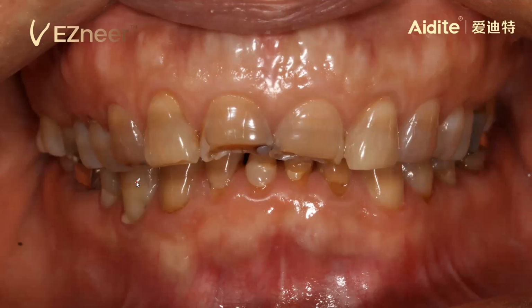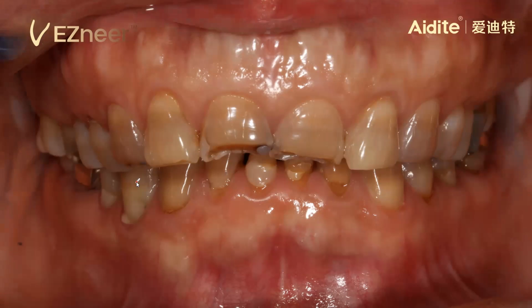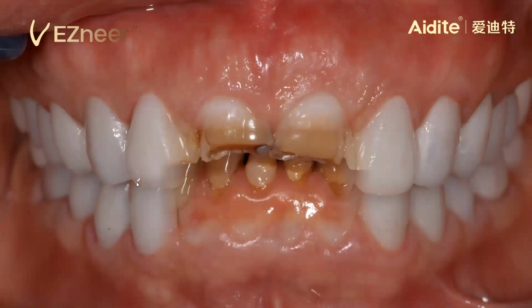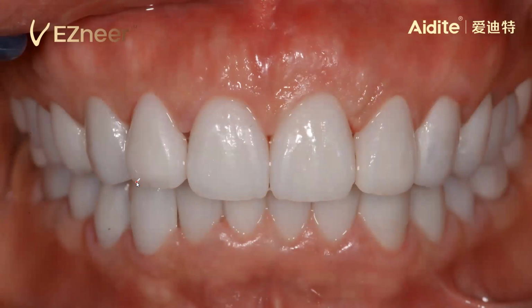And the last one we made with a professor from Peking University. We also made it with the EZneer, to cover the dark colors. And this one also changed the bonding surface. And we can see this is the result.